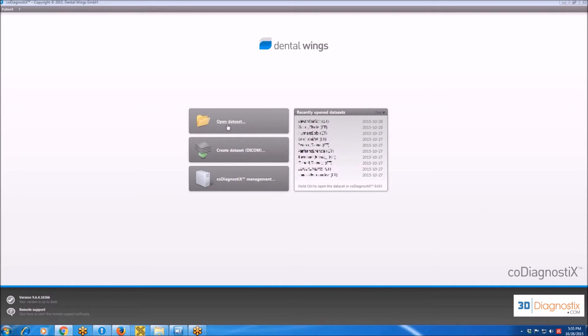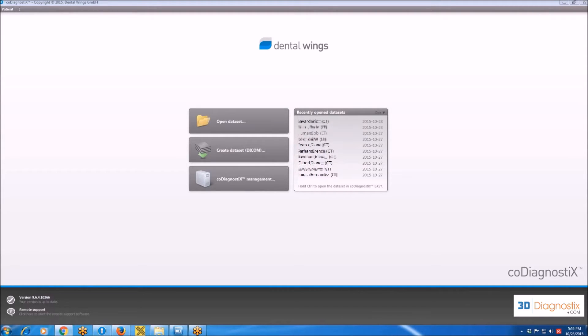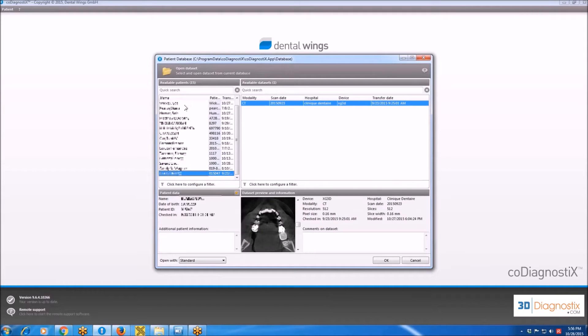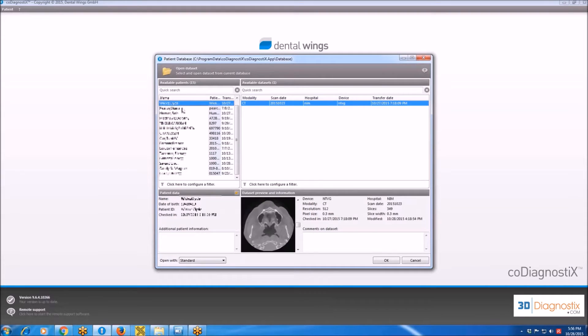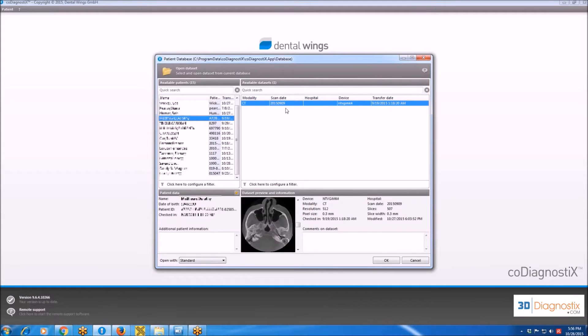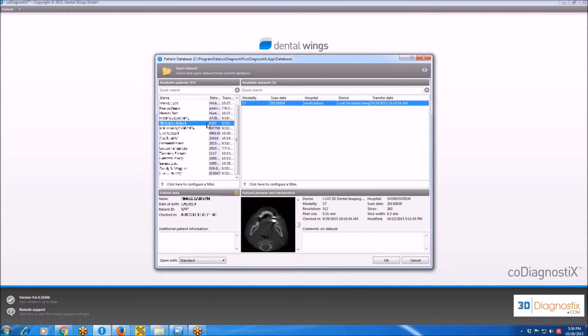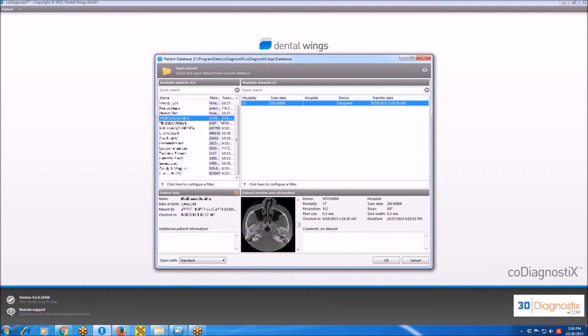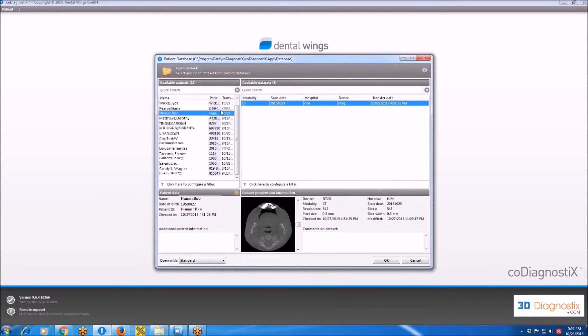First button, Open Dataset, which is basically another way to open any recently opened datasets. So you can either click on any patient's name or click on Open Datasets and you get all the patient's names on the left with some details about the patient: patient date of birth, ID, hospital name, the scanning machine used for the patient. Then click Open to open the patient dataset.